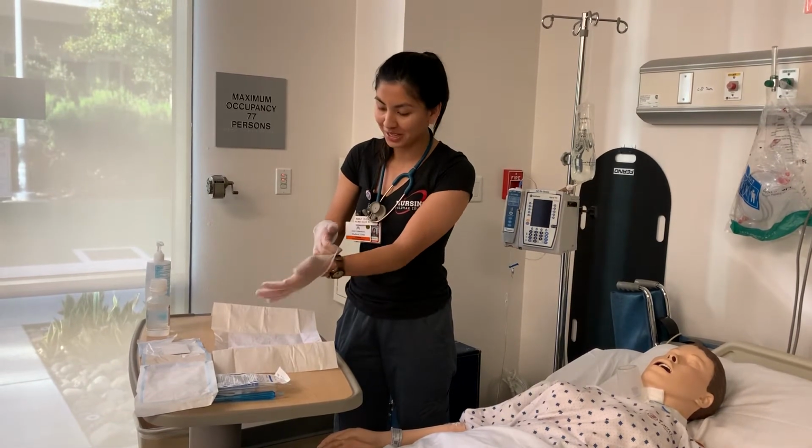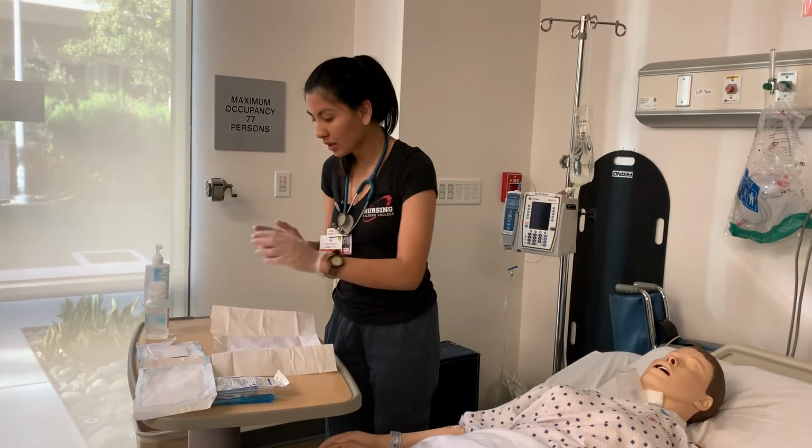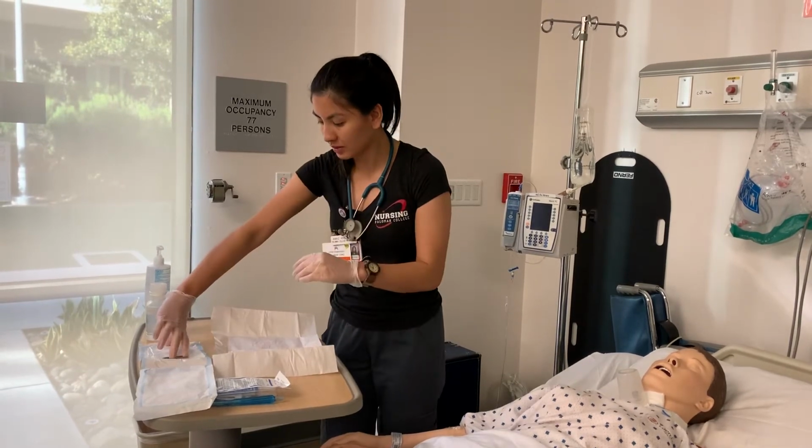If I broke sterility, I would have started again. I'm going to go ahead and get this open.